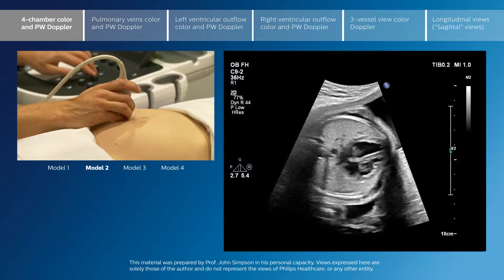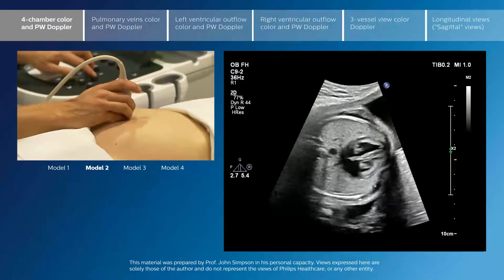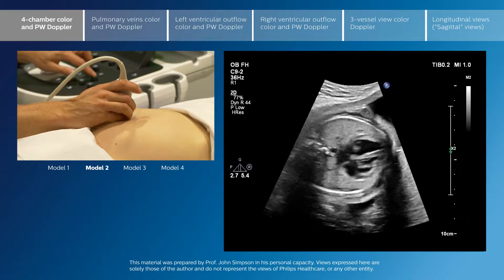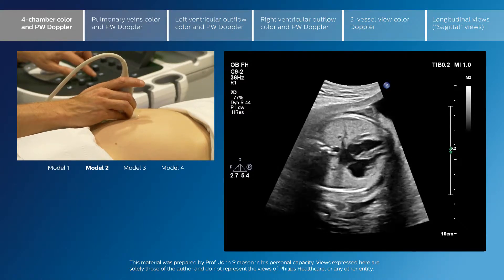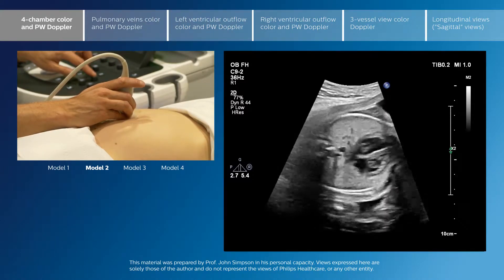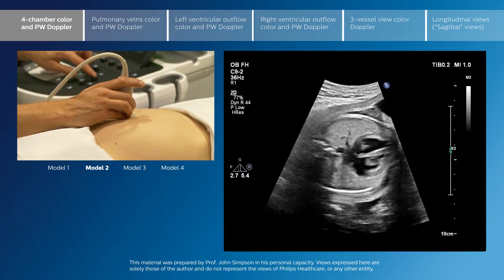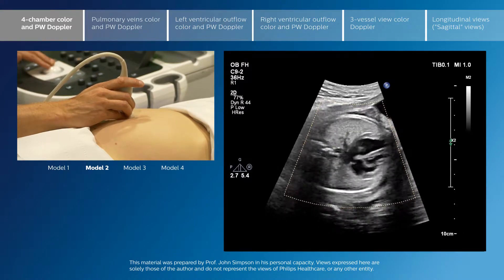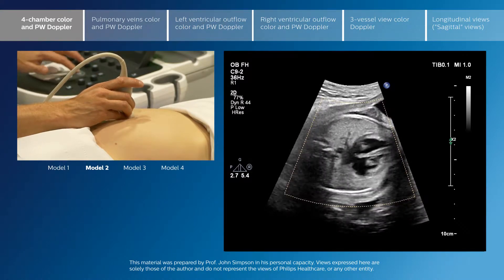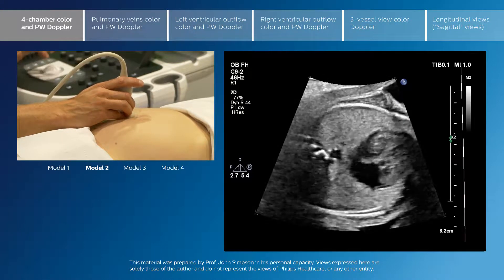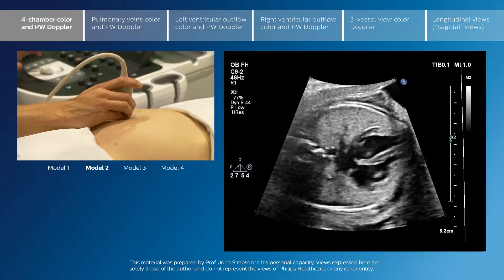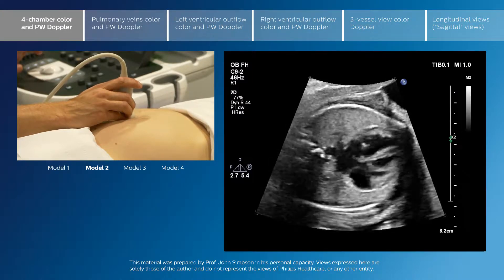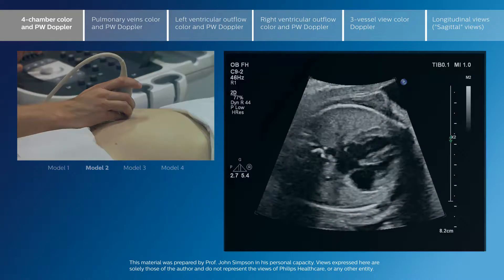We are going to start with some more advanced views of the fetal heart. I would emphasise that the starting point for anyone is to make sure that the core screening views are normal, and to start with cross-sectional imaging before moving on to any of the more extra modalities that we're looking at here.